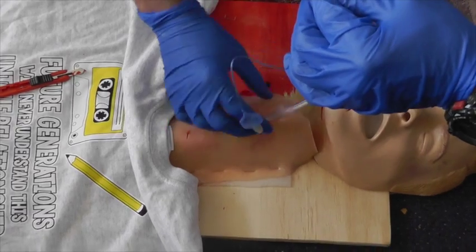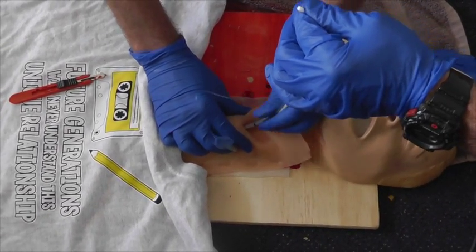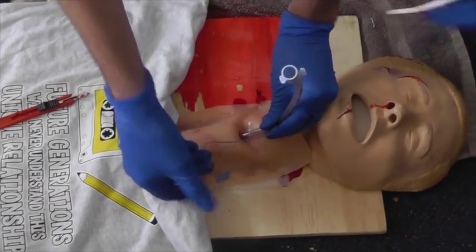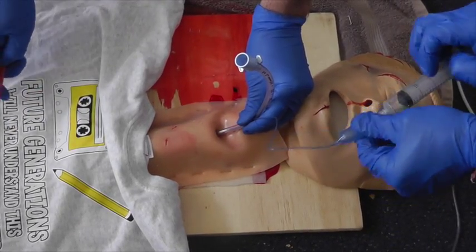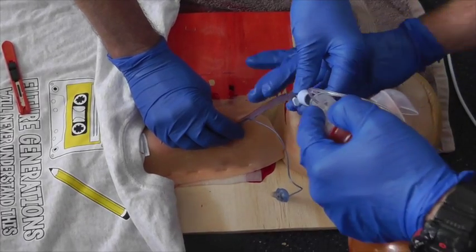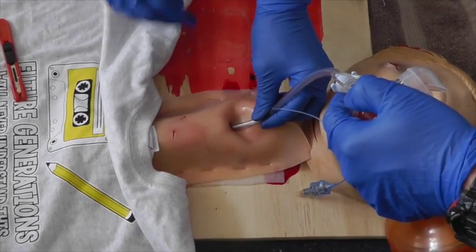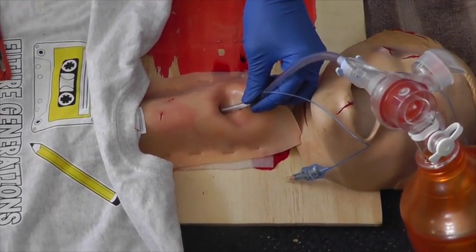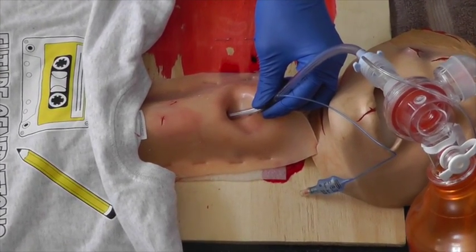I've got the bougie. I have the tube — tube going in. Cuff's through the skin. Bougie out, please. Bougie's coming out. Inflate the cuff — cuff's going up. End-tidal CO2 connected. I still have the tube — please squeeze the bag. Looking for end-tidal CO2. Listening to both sides to exclude right main bronchus intubation. Good waveform on the end-tidal CO2, good chest rise.